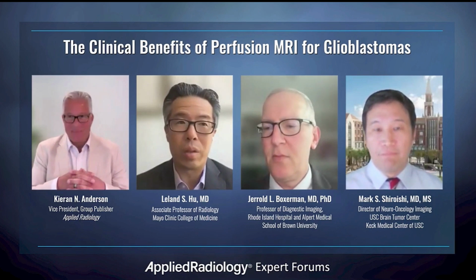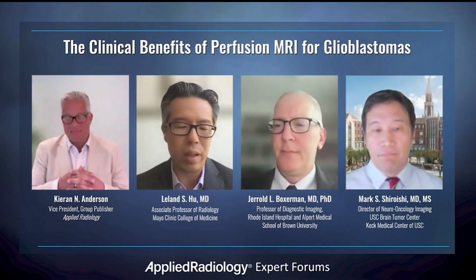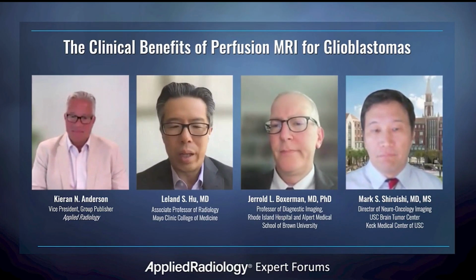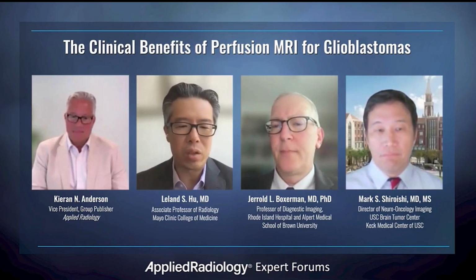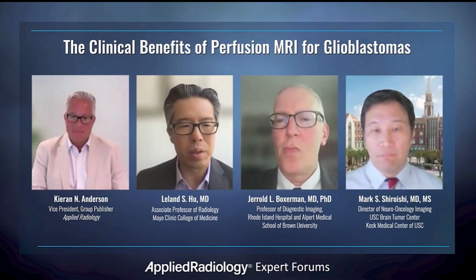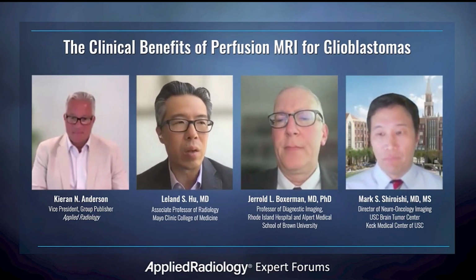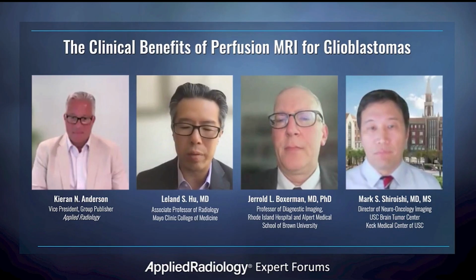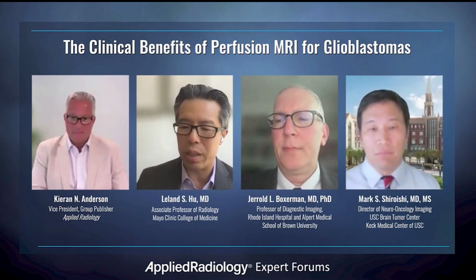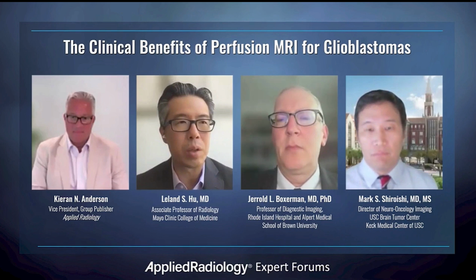Sure. No, I agree with Doctors Shiroishi and Boxerman. And one thing that I might add is that it's great at assessing non-enhancing invasive tumor. And it doesn't have to be in the post-treatment setting. It can actually be upfront. We know that a lot of these high-grade gliomas and GBMs are incredibly invasive. The contrast enhancement itself only captures a subsegment of that with blood-brain barrier disruption.